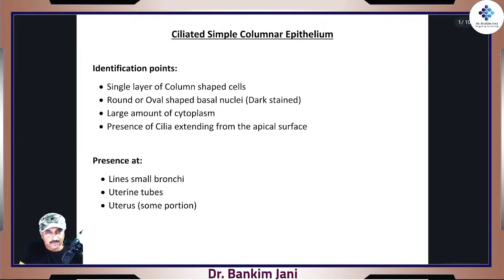See, this is between a stomach and salivary gland slide. We'll come to how to identify the organ, because we have not yet talked about the muscles or the characteristics of salivary glands, or what other structures we see. For example, in salivary gland there would be a duct. In stomach there is no duct. In stomach there is a lumen.